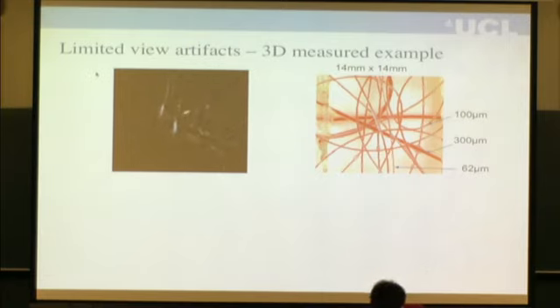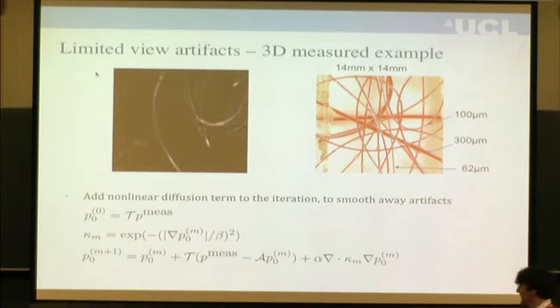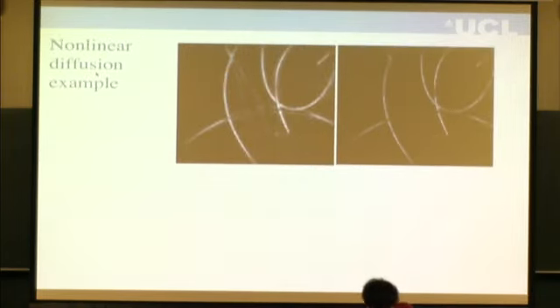So, given my sort of engineering training, we can do stuff to deal with these artifacts. It's not necessarily a beautiful thing, but we can smooth them away to some extent. So we applied the same iteration that I talked about before when you've got a visible region to get it exactly right. We haven't got a visible region, but hopefully incorporating that prior data is going to help improve the image. And then we've stuck on another term just to sort of control the noise and, well, it's slightly edge preserving. Okay, so it's fairly standard techniques, and it helps.